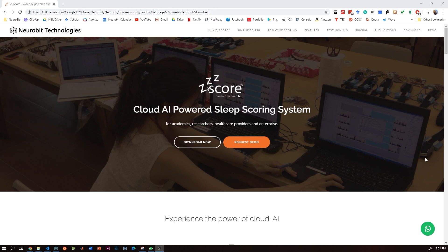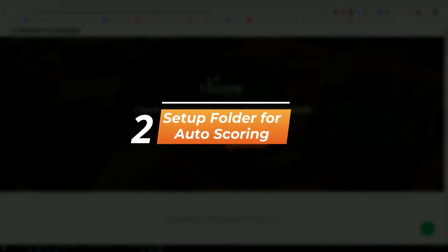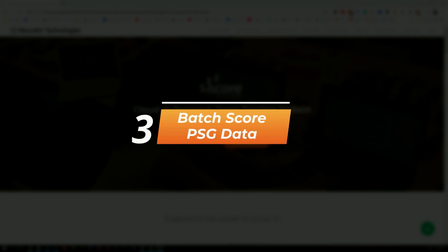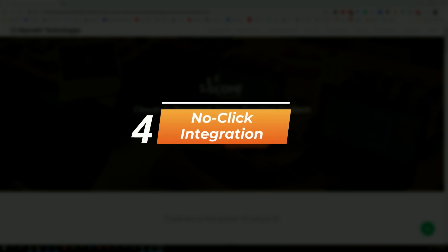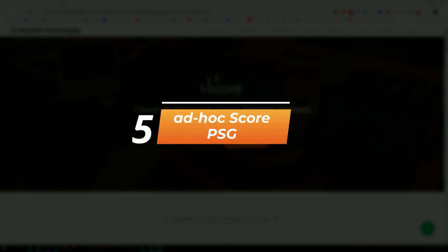Welcome to the z3score quick start guide. In this video we will learn how to install z3score and set up licensing, set up a folder for auto-scoring, batch score EDF data, set up no-click integration where data gets scored as they come in, and finally how to score a single file ad hoc.